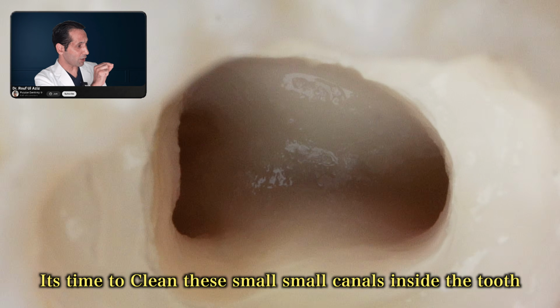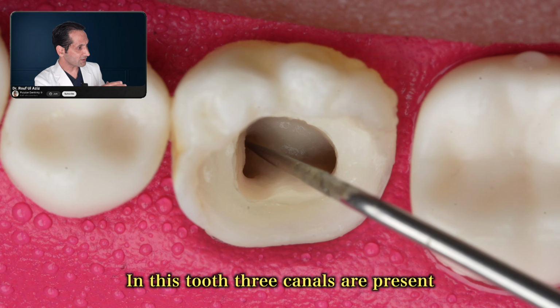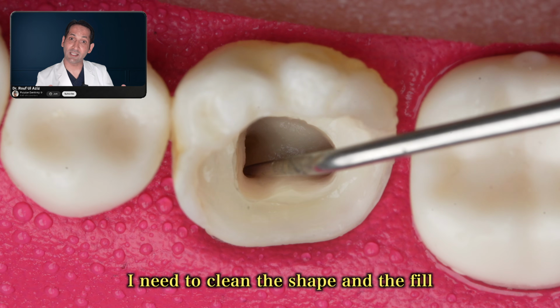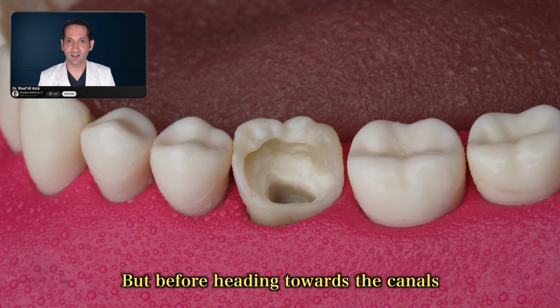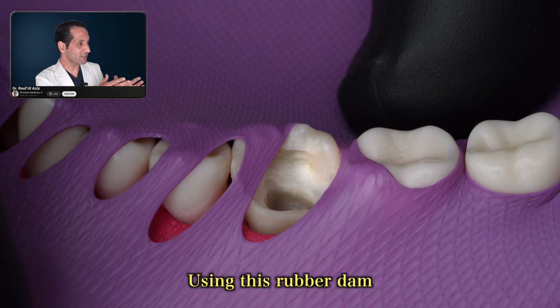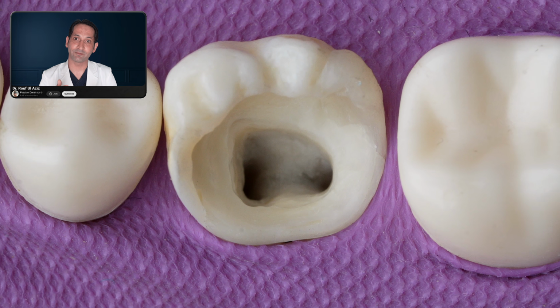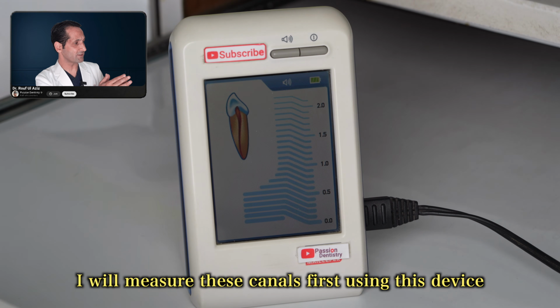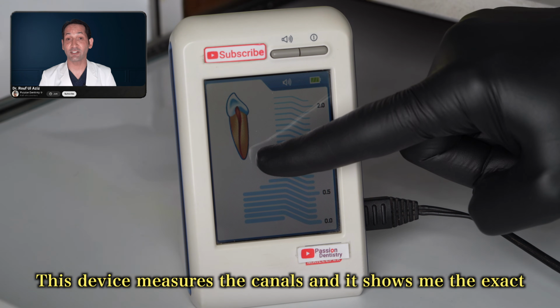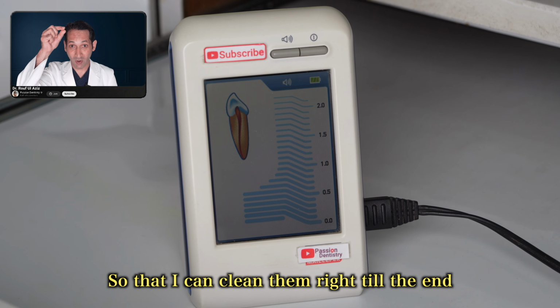It's time to clean these small canals inside the tooth. Like here, in this tooth, 3 canals are present. I need to clean, shape and fill all the 3 canals. That's what actually happens in the root canal treatment. But before heading towards the canal, I will isolate this tooth using this rubber dam. Rubber dam prevents the contamination of canals from the saliva. And after isolating the tooth, I will measure these canals first using this device. This device measures the canals and it shows me the exact end of those canals so that I can clean them right till the end.